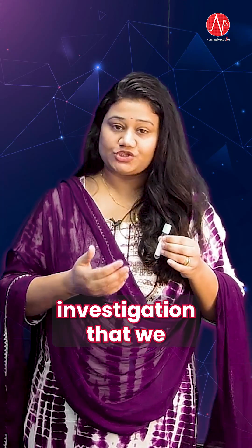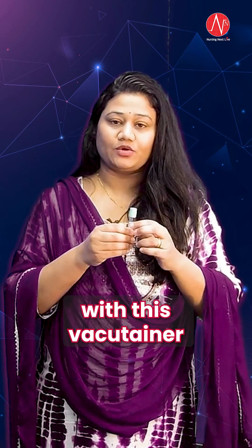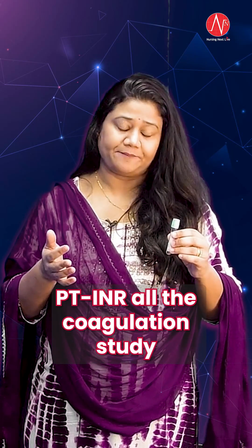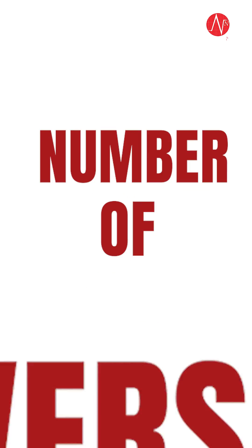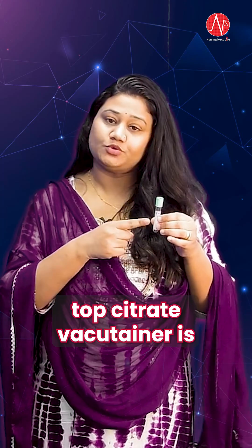Another important point — the investigations that you can do with this vacu-tainer are PT, INR, and all coagulation studies. Apart from this, point number four which we need to remember is the number of inversions. The number of inversions required for this light blue top citrate vacu-tainer is 3 to 4 times.